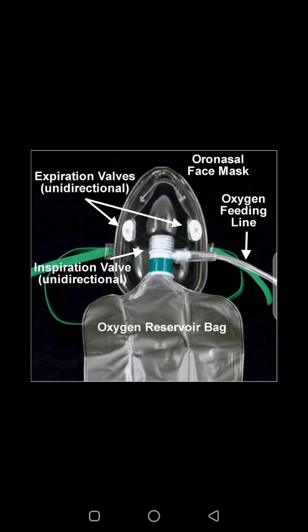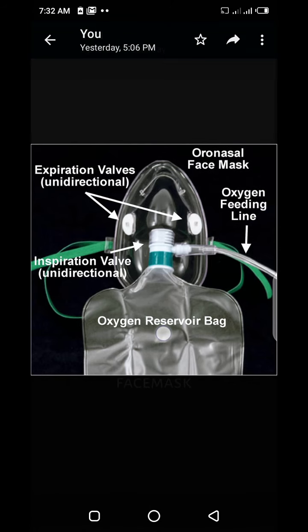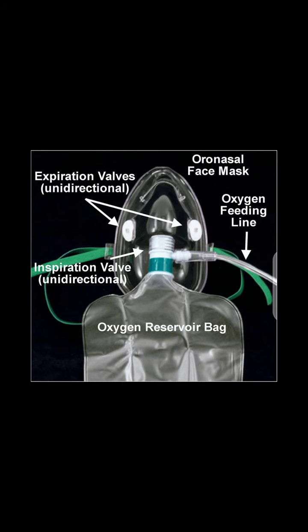When the patient inhales, it ensures that the patient takes in only the oxygen from the reservoir bag. The reason these expiratory valves close up is to ensure that the patient does not take in any air from the atmosphere, just purely oxygen. That is the idea.